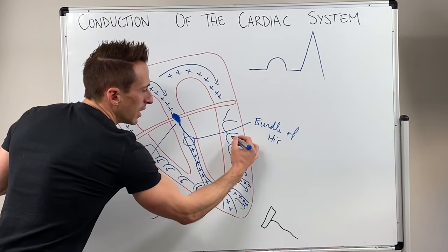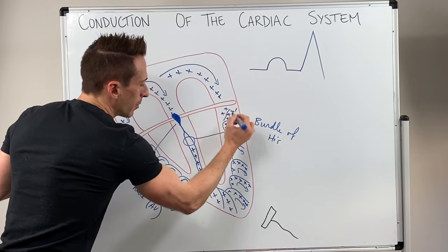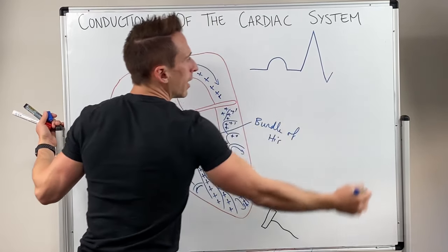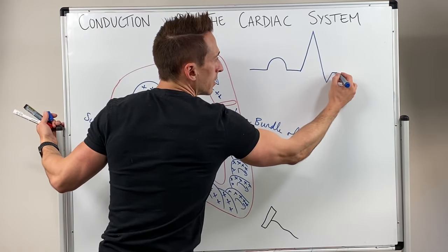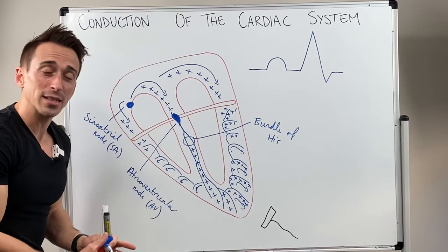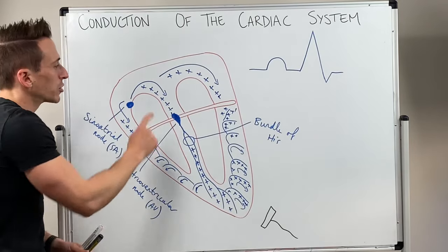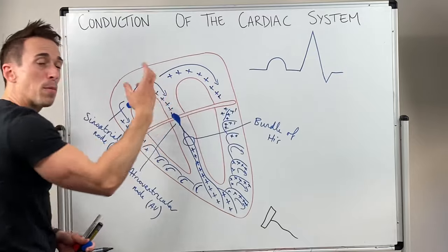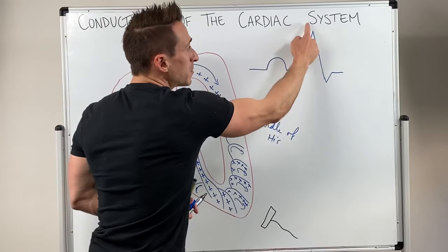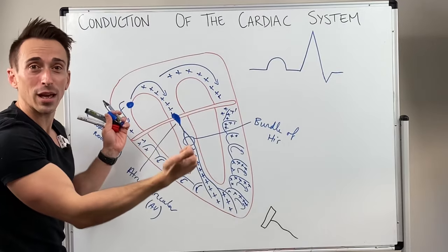Then what you have at the end is the electrical activity moving away from that lead, as you can see up here, and as you can see up here. So you get a dip down. And then back to that charge again, that isoelectric point, no change. Now what's happened is the whole heart muscle has depolarized, it's all gone positive. And remember, anytime it goes positive, it contracts. So when you had this bump up, it was immediately followed by those atria contracting, pushing the blood down. When you had this big bump up, it was immediately followed by the ventricles contracting, pushing the blood out.